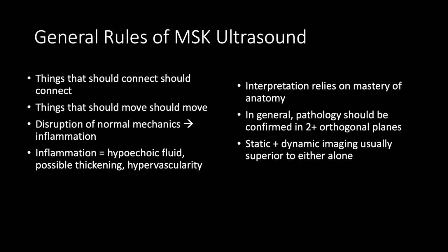When considering your approach to MSK ultrasound, some basic tenets help us orient our clinical questions and exam approach. Not to be overly simplistic, but remember that a thorough physical exam taking place prior to putting the ultrasound on a patient can often render your diagnosis on its own, or at least narrow it down to a few key areas that can then be investigated using ultrasound to make a final diagnosis.